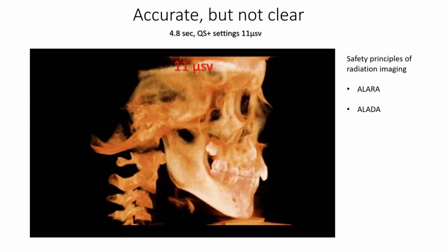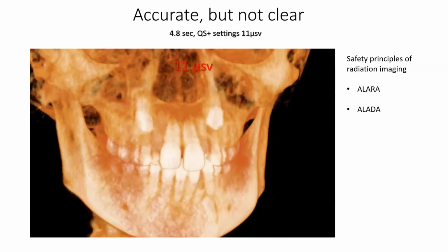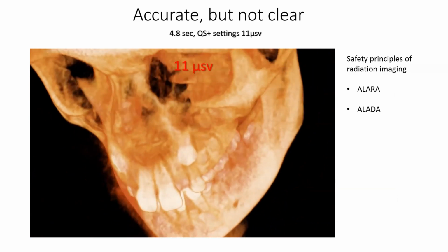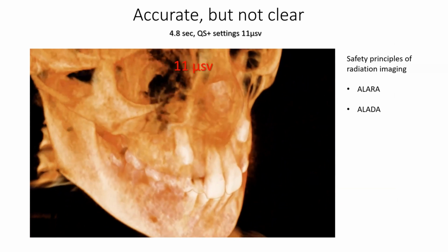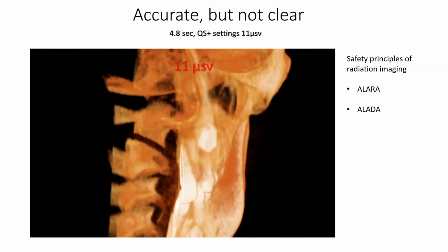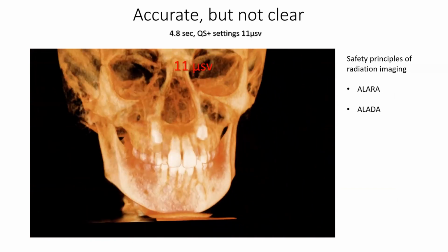This is a low dose CBCT that is equivalent to about 11 microsieverts. Now I want to be very clear that not all CBCT manufacturers, machines, and settings were created equal. This in particular is the machine that we use in our practice.